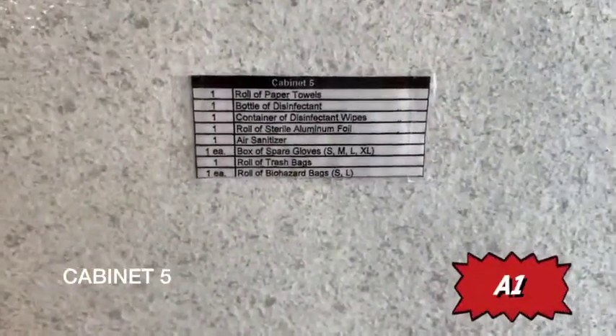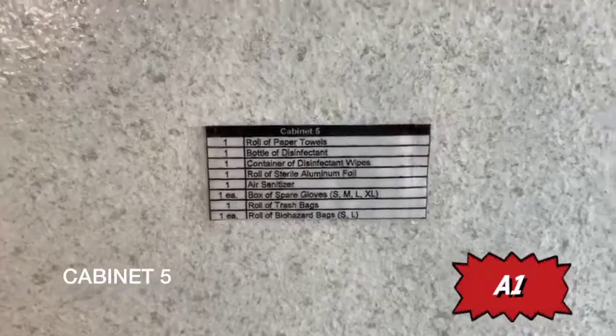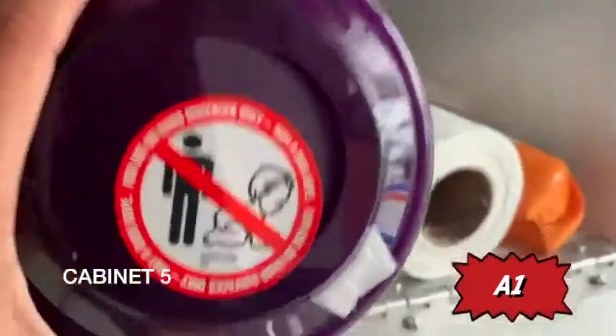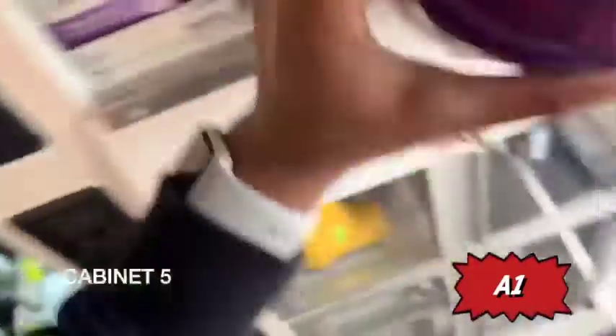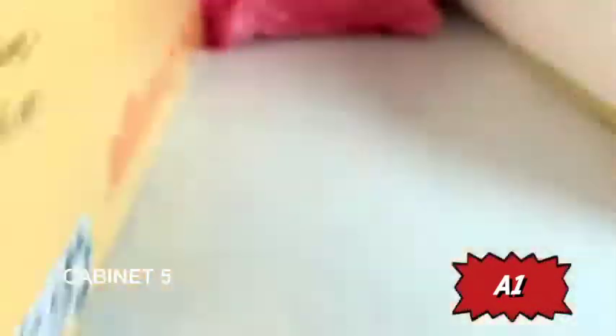Welcome to cabinet five. Here's a roll of paper towels and a bottle of disinfectant — basically how you clean the rig. You have your Lysol wipes, paper towels, hospital-grade disinfectant, more gloves in case you run out from the main compartment, and your biohazard trash bags and normal trash bags.